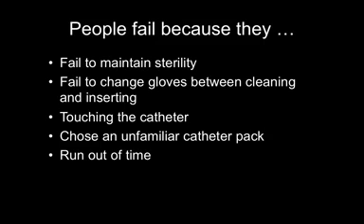The most common reason for people failing is a failure to maintain sterility. Other issues that people have is they're not changing the gloves between cleaning the site and inserting the catheter, touching the catheter itself. One common theme that turned up was students picking up a catheter pack from another site, and this caused confusion when they were actually performing the procedure because the equipment may be slightly different. There may also be issues of timing here. Whilst you shouldn't fail for not completing the procedure, you at least need to be a good way through it for the examiner to be able to assess you properly.